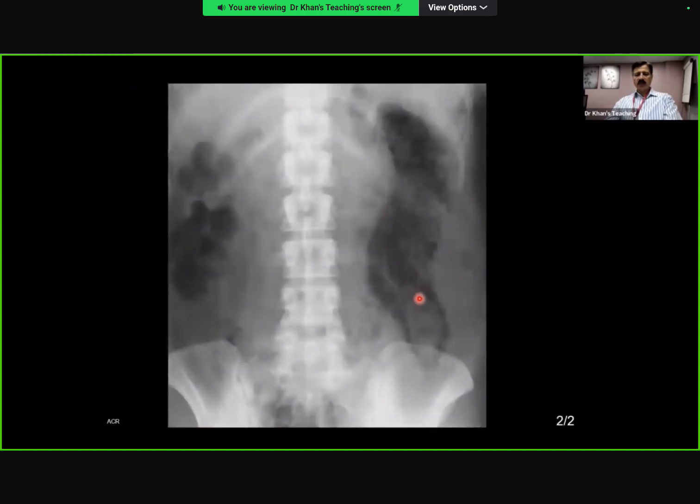And look at this plain film. On the plain film, it gives you that, again, that Aunt Minnie appearance. And look at the ones which are in the profile. Now, in our hospital, we have got a very interesting case in which I've got CT going back about 10 years for this patient, who has presented 2 times to our hospital with pneumoperitoneum without any peritonitis.